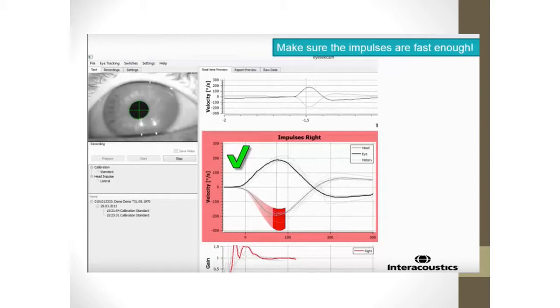And you end up with a graph like this that shows you head movement versus eye movement. This is, in this case, the head movement here. And you simply are trying to move the head fast enough that it falls within this red area. And when it does, you get this green check mark.